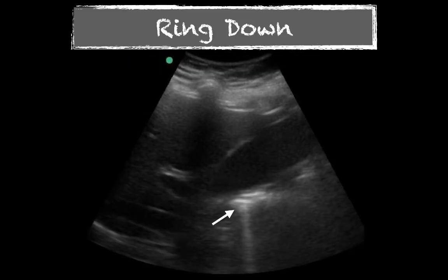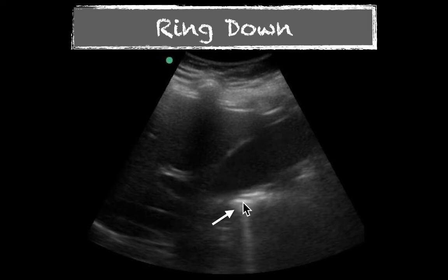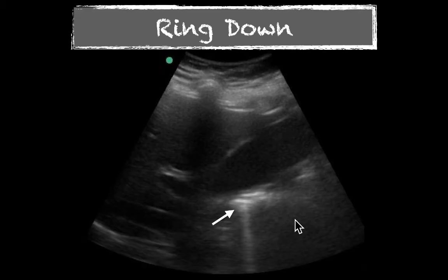Ring down artifact is similar to comet tails and reverberation artifact. Here we have the gallbladder and some bowel just posterior or deep to it. You can get what looks like a structure created right here — this would be our ring down artifact. Once again, that represents a structure that's not truly there, but it's confusing to the machine, so it creates that structure on your image.